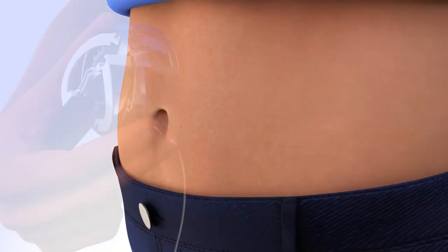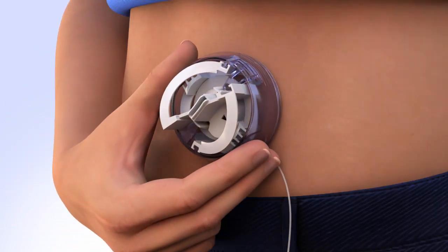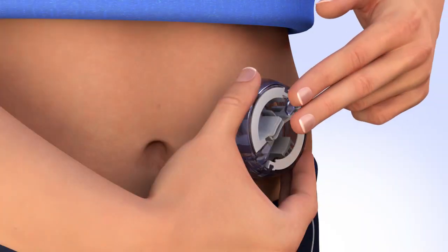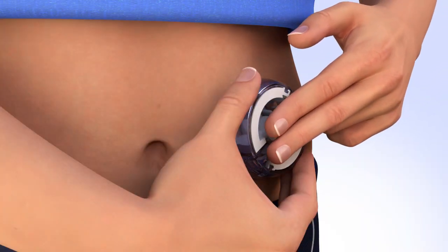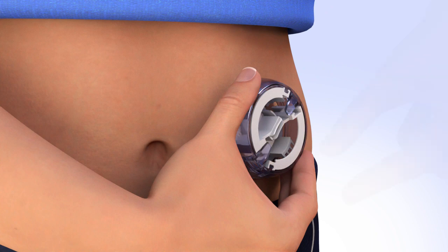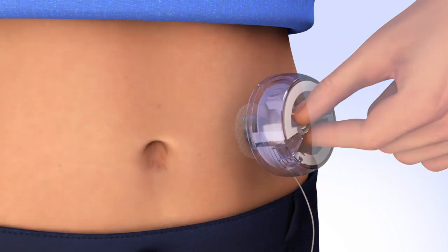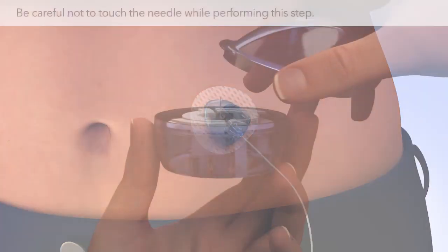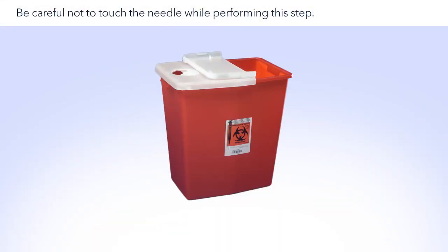Place the Mio infusion set flat against your body over the prepped site. Do not pinch up your skin. With the serter secure against your body, press the round indentations on both sides of the insertion device at the same time to release and insert the infusion set. Push on the center handle to secure the adhesive onto the skin. To remove the serter, hold the center handle and gently pull it straight out. Smooth the adhesive securely onto the skin. Put the lid back on the serter and dispose of it properly.